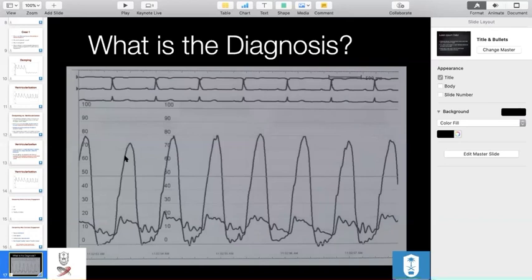What about this waveform? Okay, you see there's only one peak, so it's either going to be ventricular or arterial, right? But look at diastole. You can't see really clearly if there's any A wave here, maybe this one here, but there's a lot of wiggle you cannot trust, so you would not rely on that as a differentiator. But if you look at the diastole, it's actually upsloping, right? Or horizontal here. Given it's one peak, not two peaks like an atrial, and it's upsloping and some horizontal, this is likely a ventricular tracing.